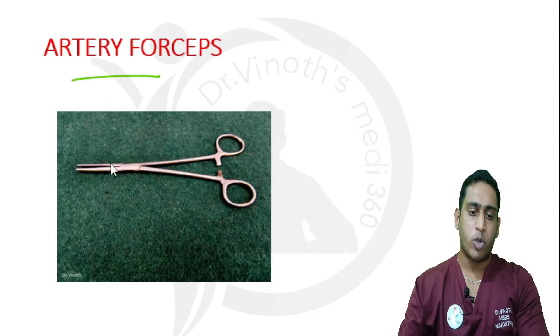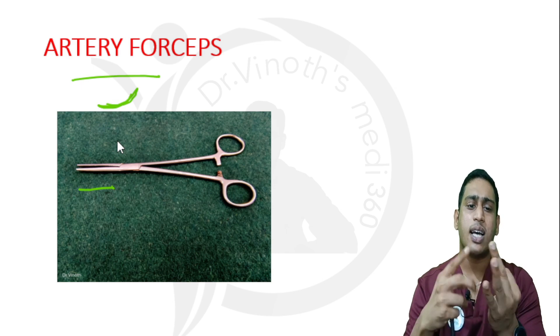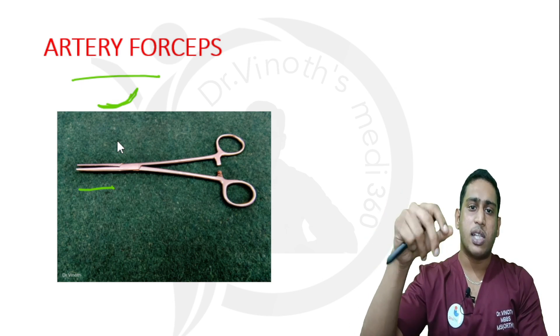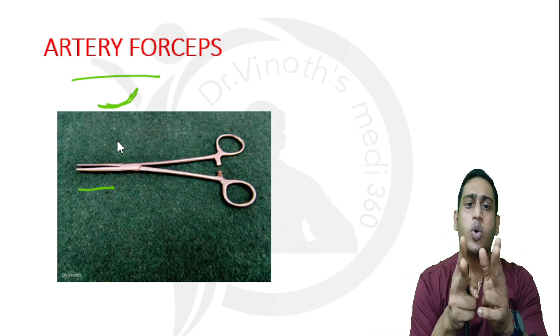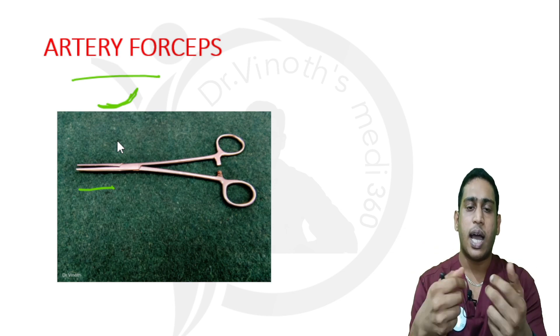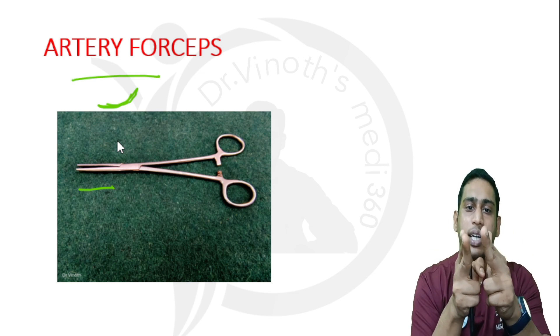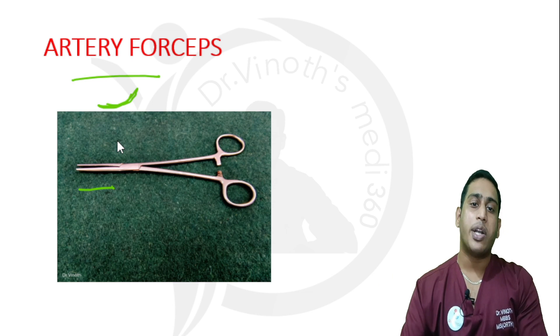This is an artery forceps. There are two types: a straight artery forceps and a curved artery forceps. Their main purpose is dissection. As the name suggests, they are also used to hold blood vessels and for cauterization. Sometimes when we need to hold a structure — for example, in tendon reconstruction or tendon suturing — we need to hold the tendon and bring them together. That time we can use the artery forceps.